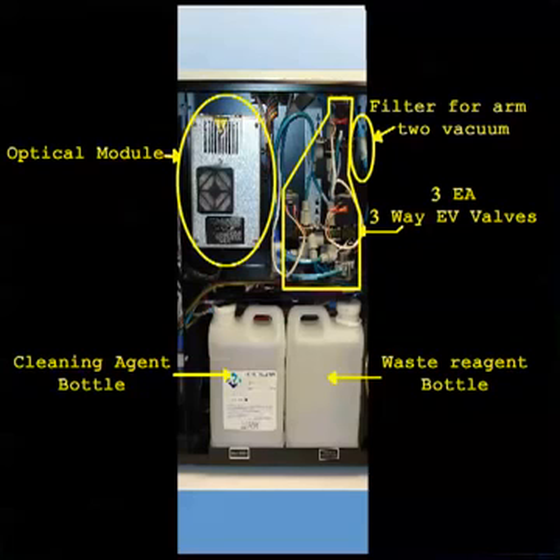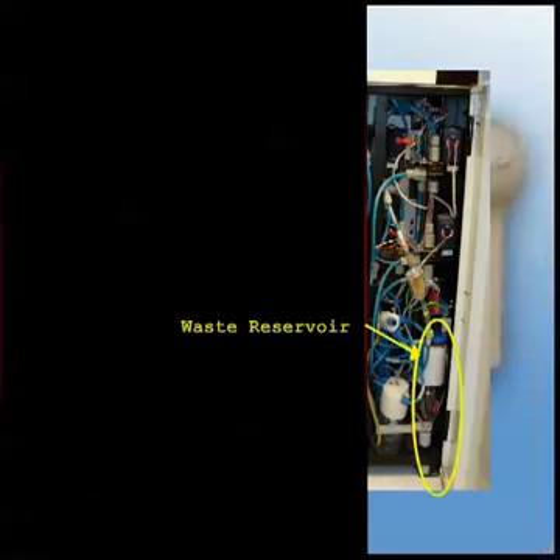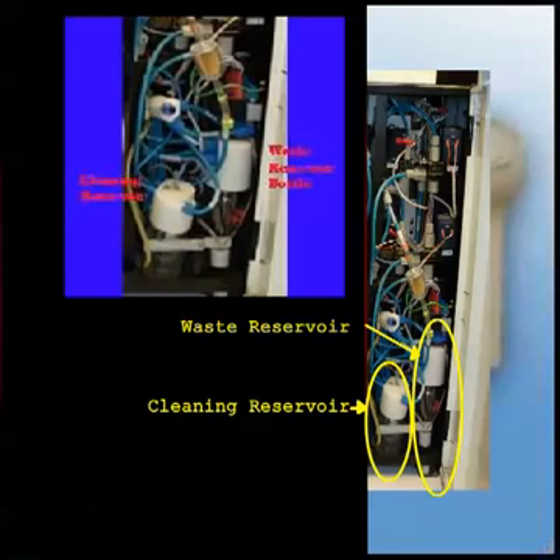Below that, at the bottom center, you have the cleaning solution bottle and the waste bottle. At the bottom far right, you have the cleaning reservoir bottle, which gets its cleaning solution from the large cleaning reservoir mentioned earlier. Right beside it is the waste reservoir bottle at the far back of the instrument. The cleaning solution bottle should always have solution in it; the waste bottle will have different degrees of waste.